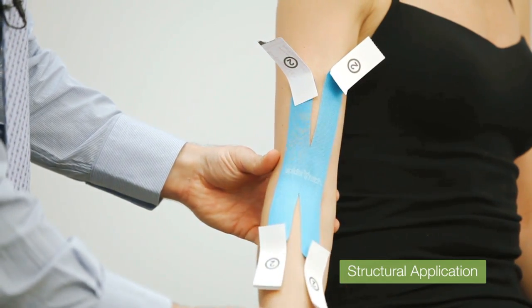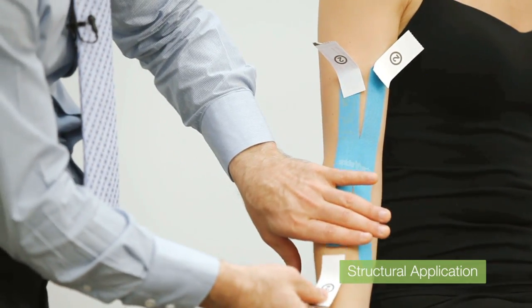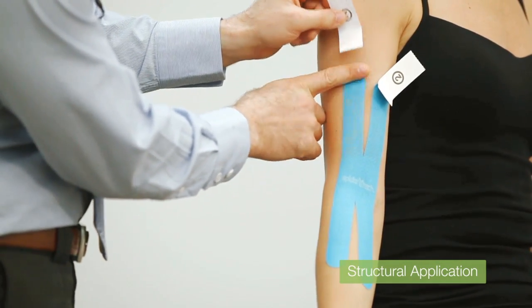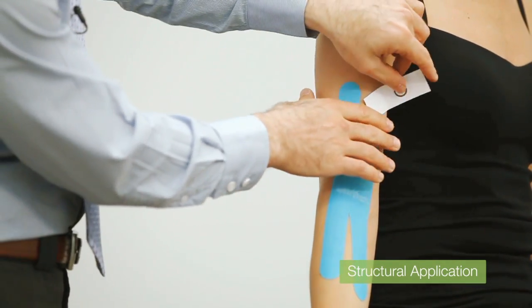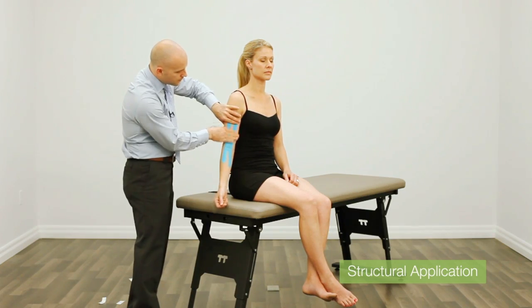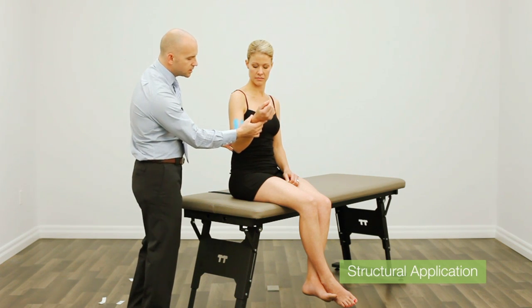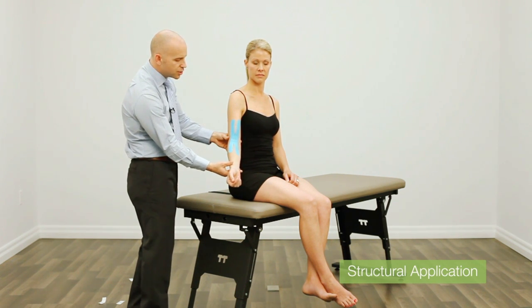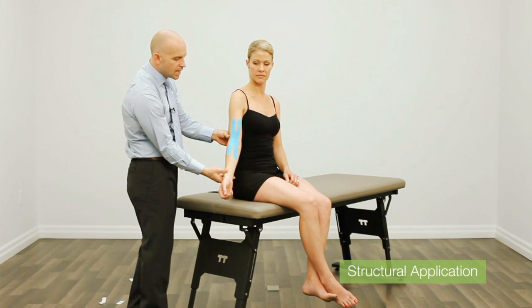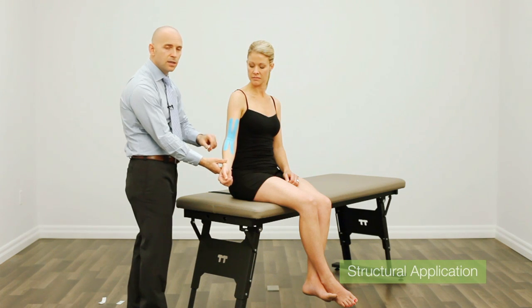From there, we let the arm straighten out and remove the final portion of the tape. For any structural application, always leave the final portions with no stretch on the tape. So when the patient ends up bending their arm, as they start to straighten their arm out, they'll feel tension pick up on the tape, which keeps them from going into full extension, giving them that kinesthetic awareness to help protect the injured area.